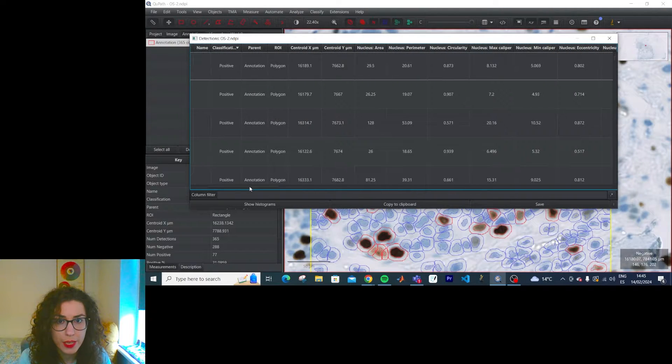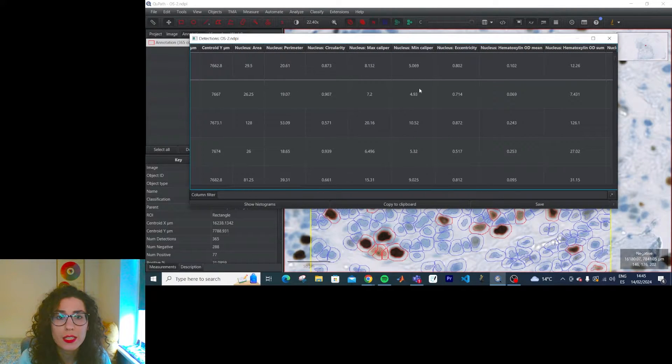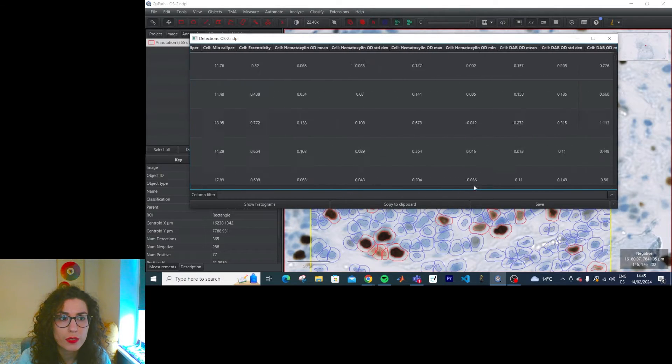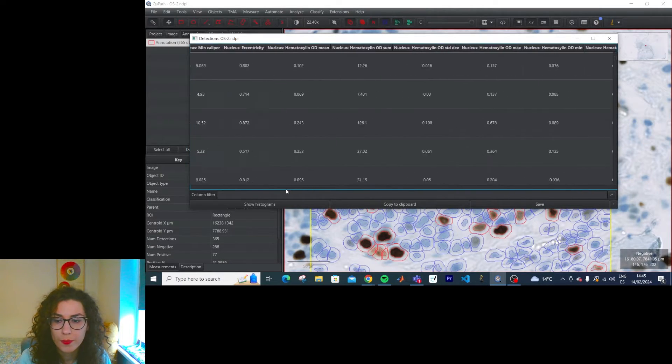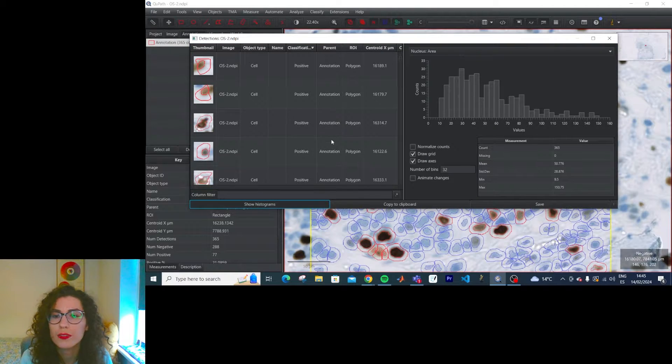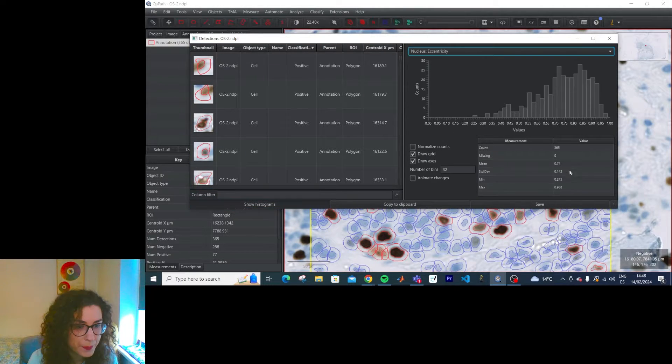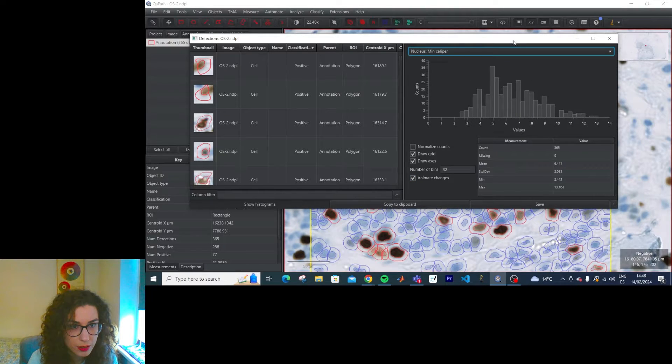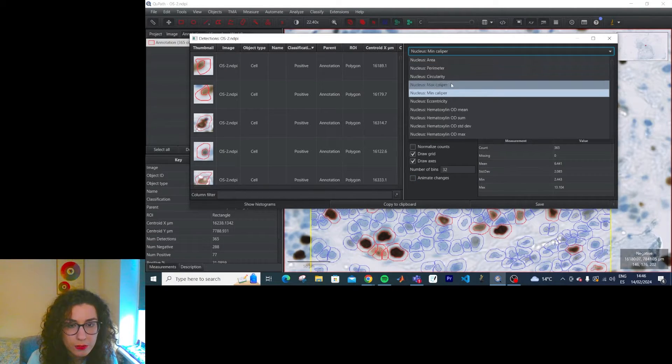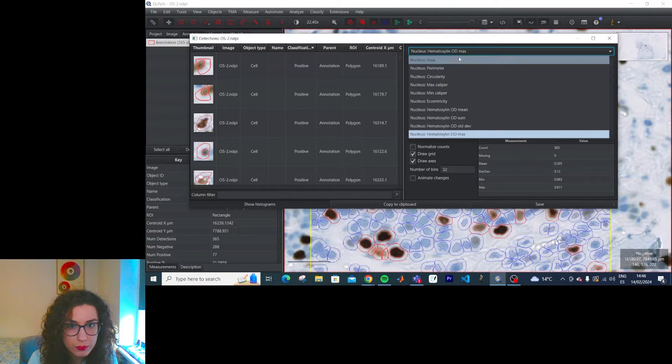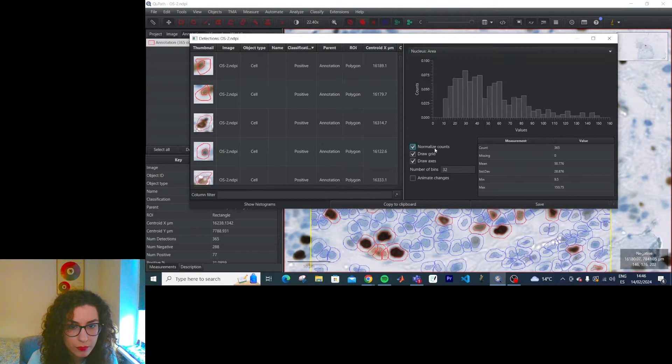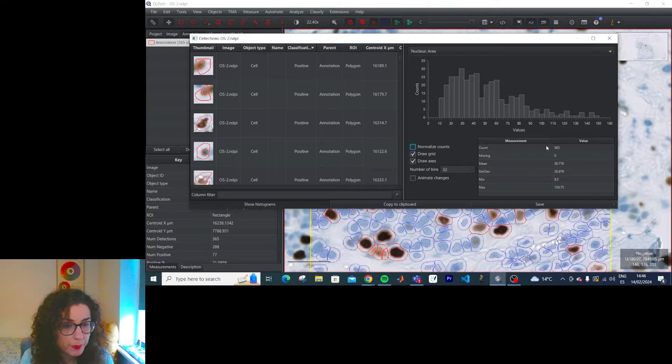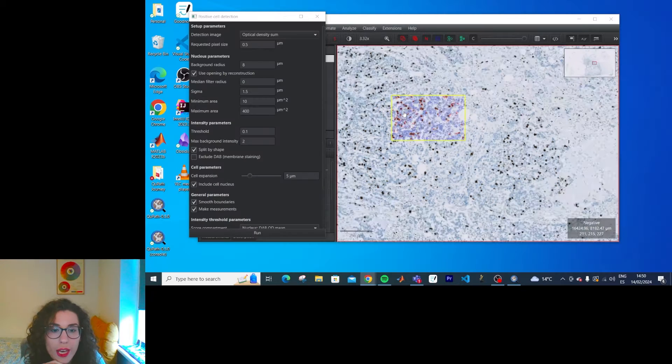And how much information. So the area, perimeter, circularity, lots of information for each of them. Oh, it's histograms as well. Oh, I love histograms. Great. Why does it animate changes? Great. Love it.